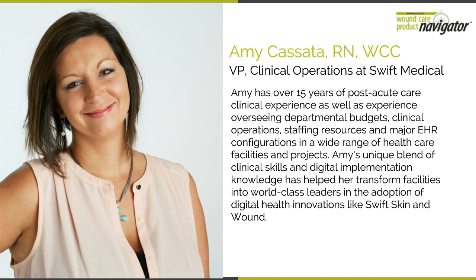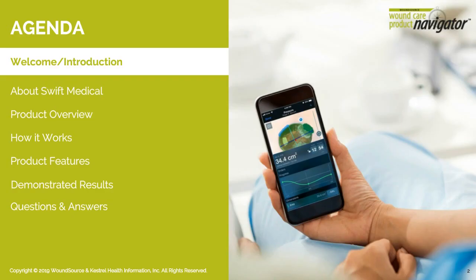Thank you for the introduction. A few things we're going to go over are Swift Skin and Wound, a high-level product overview, how it works, some of our features that are available across different contexts, how we demonstrate our results in the settings, and then our Q&A section.